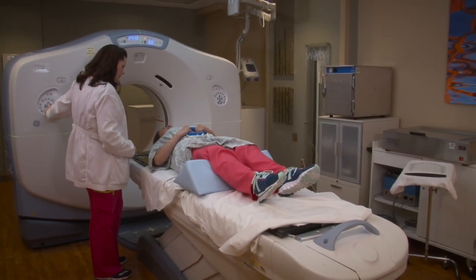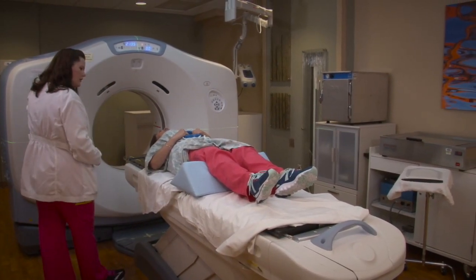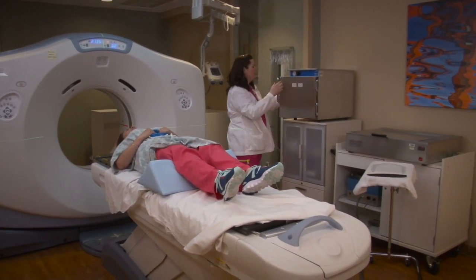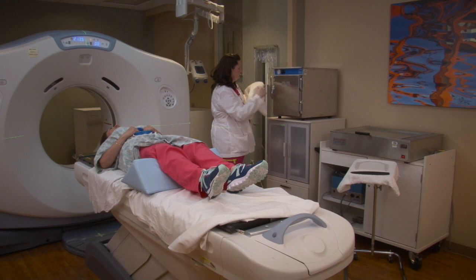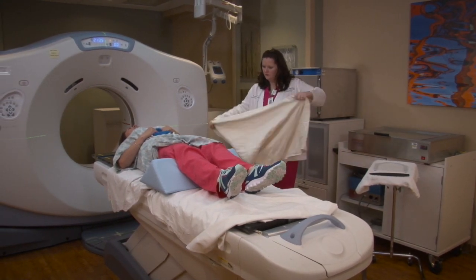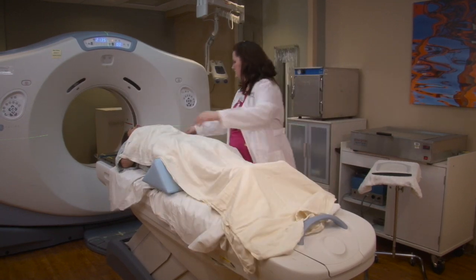During simulation you will lie on the treatment table. Your job during the entire CT simulation process is to hold still, breathe normally, and relax. It's especially important for you to try to avoid any movement. We will position you in the precise way you will ultimately be treated.